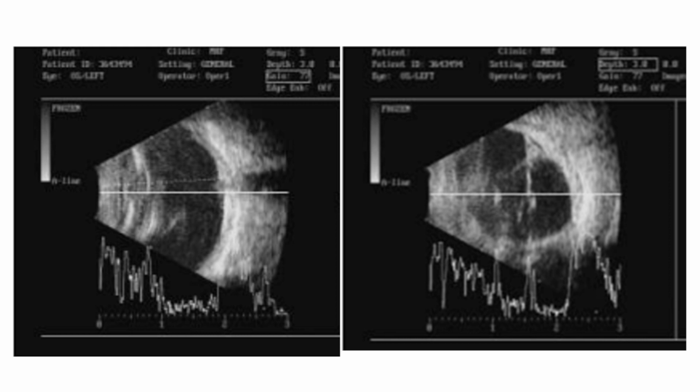Yes, ma'am. So, this is the inferior scan, and beneath the lens echo inferiorly, in the anterior part of the eye, there was a granuloma. Where is the granuloma in the image? I think you are getting a little confused. It is a peripheral granuloma, inferior quadrant, so point out the granuloma.